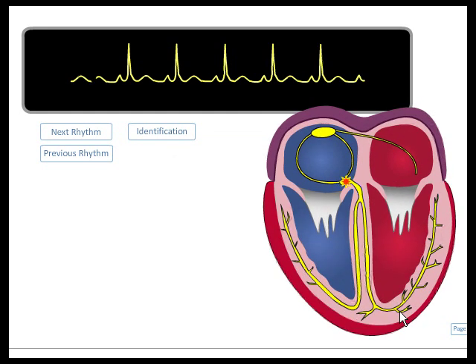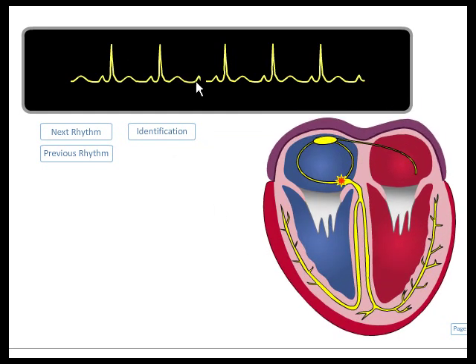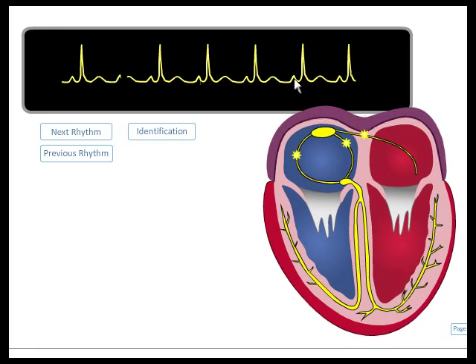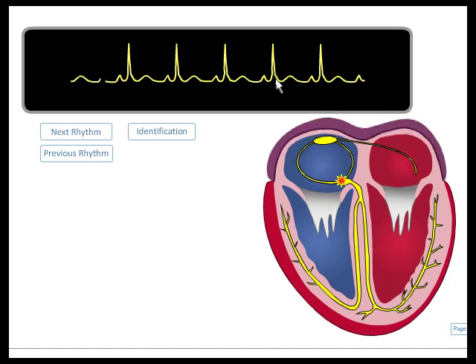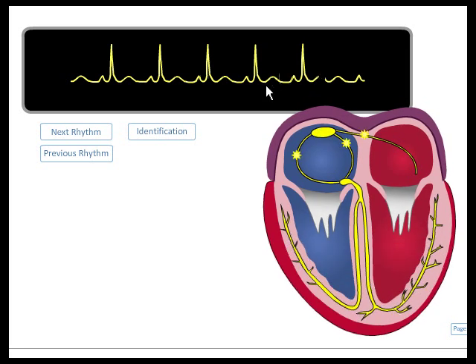In this first rhythm, we have a regular rhythm with a P wave in front of every QRS. The PR interval is constant with normal width, and the QRS is narrow. The rate is about 65 to 70.